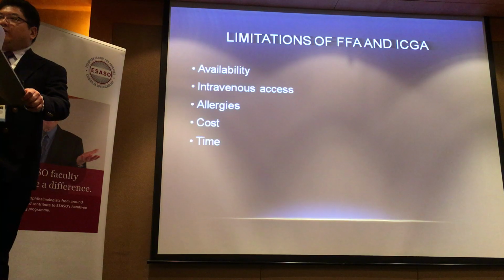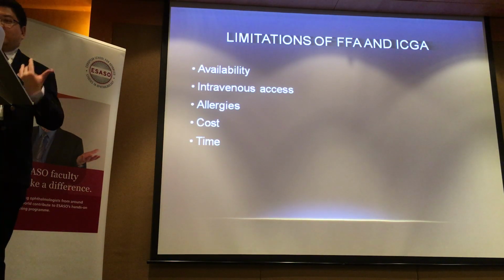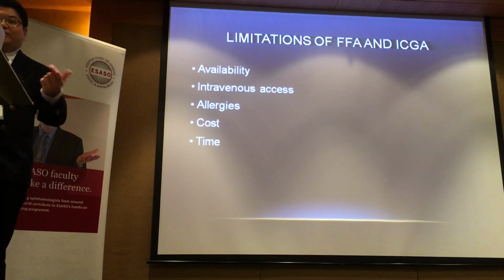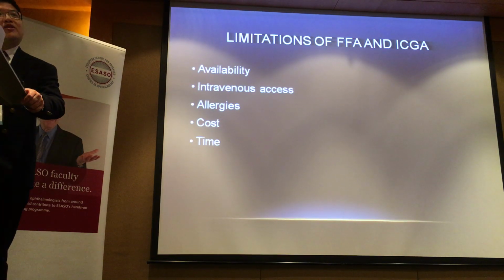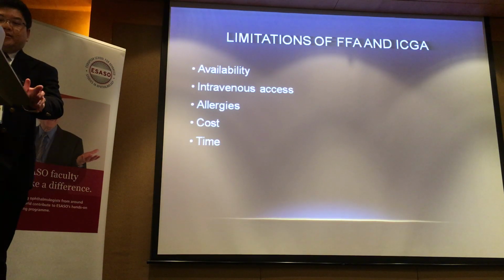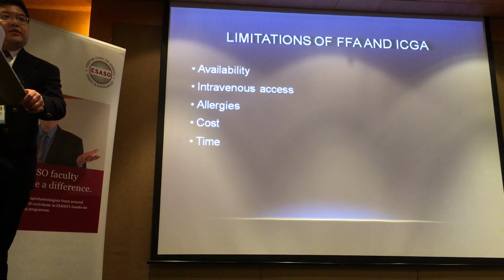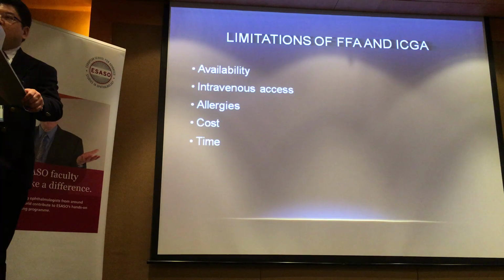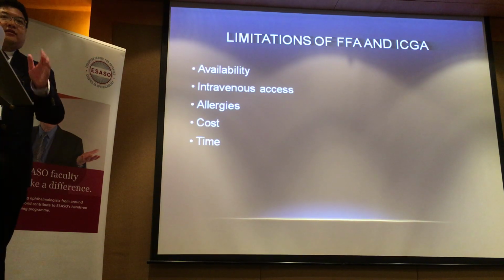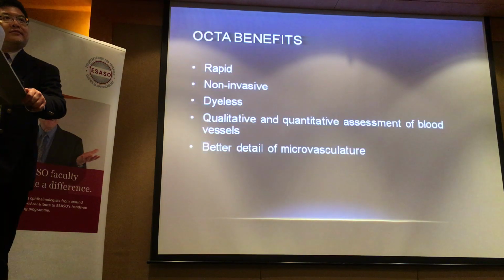Doing a conventional angiogram, you need intravenous access. So that means you need to insert a cannula. Of course, that can cause problems, although that's usually not a big thing. There's a small risk of allergies to the dye. The investigation can be costly as well, and it takes time because the entire angiogram will take at least 20-30 minutes, depending on how long you want your late phases. So these are all factors that you have to take into account, especially in a busy practice.